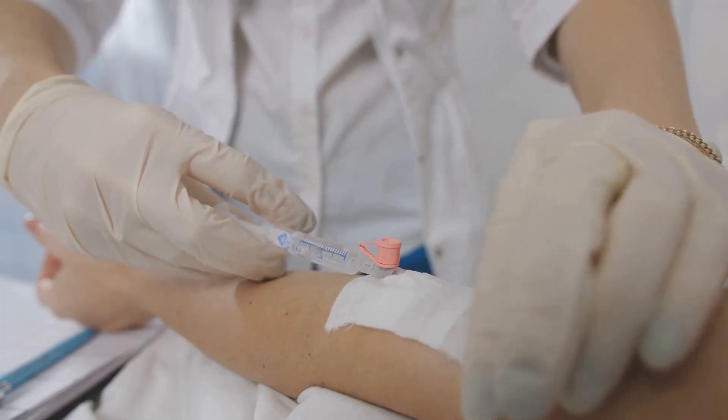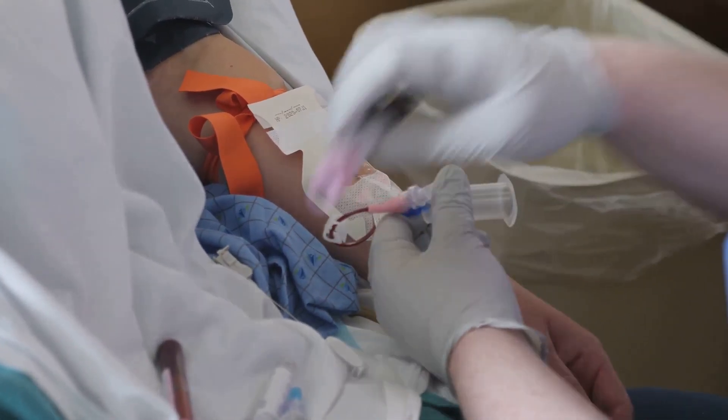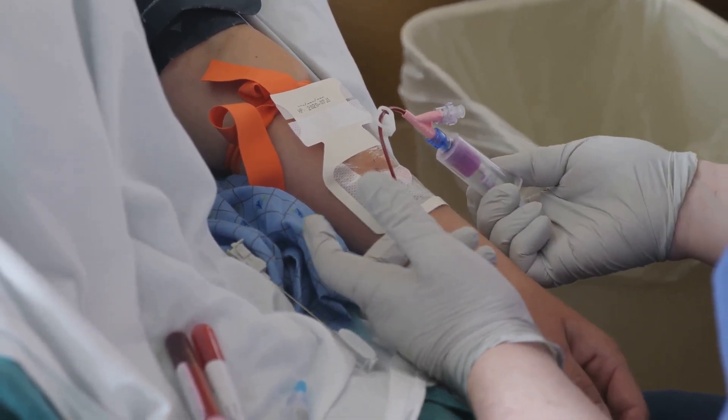Think of cannulation as your gateway to patient care. It's like opening a direct line to deliver essential medications, fluids, and even blood transfusions when needed. Pretty cool, right?